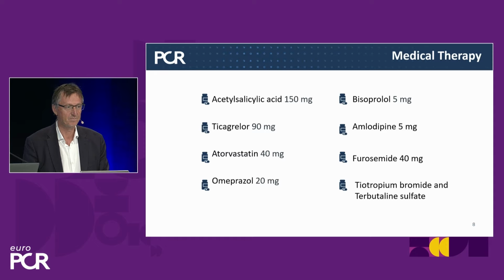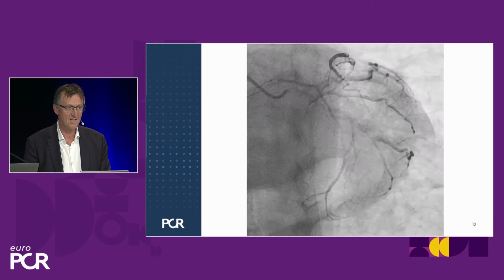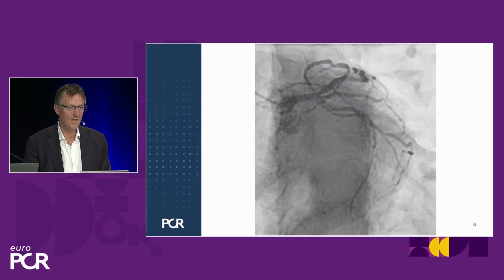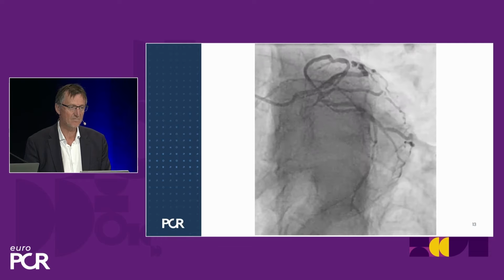This is the angiographic shot from the left. What you can see here is a calcified lesion in the proximal part of the circ and a very high takeoff of the first obtuse marginal. Other projections show disease all the way up in the ostium of the circ, and some changes in the LAD and the left main, but not very significant. You have different projections here, and the right was without significant disease.